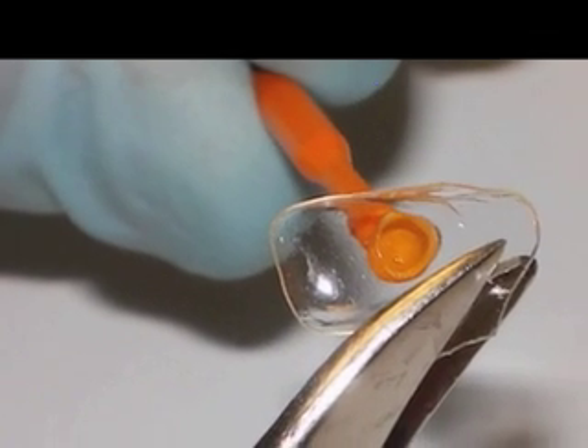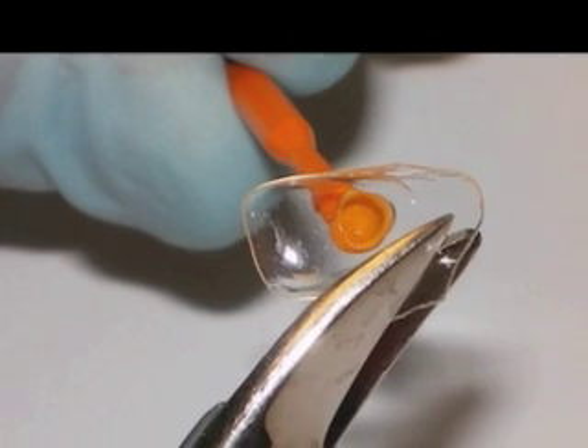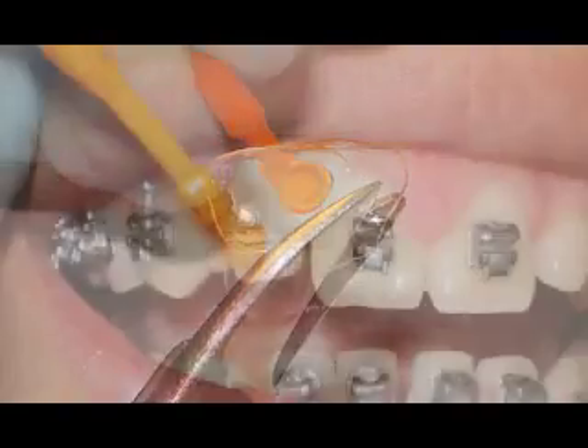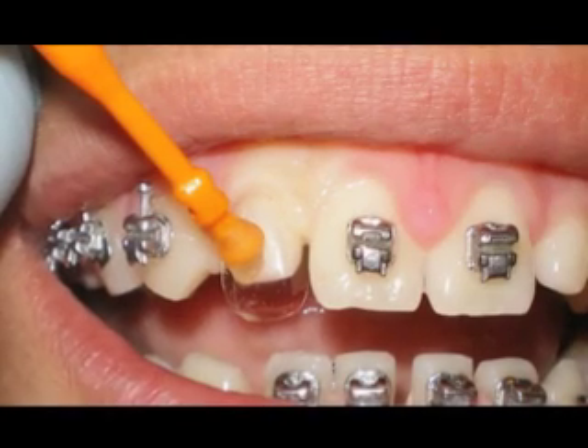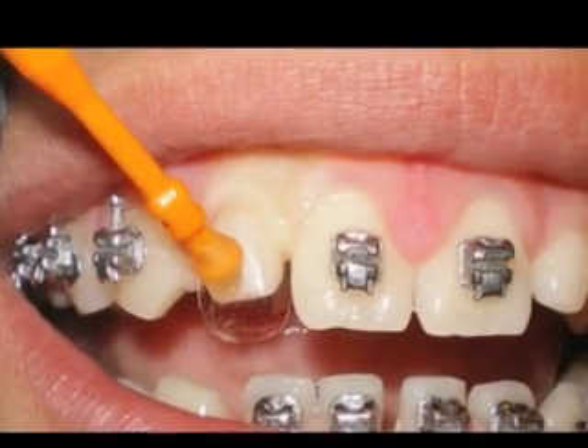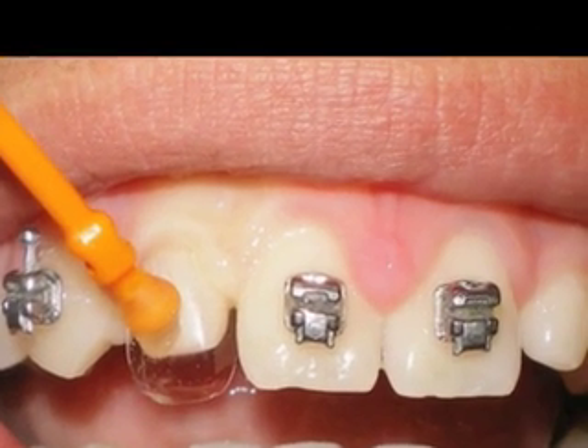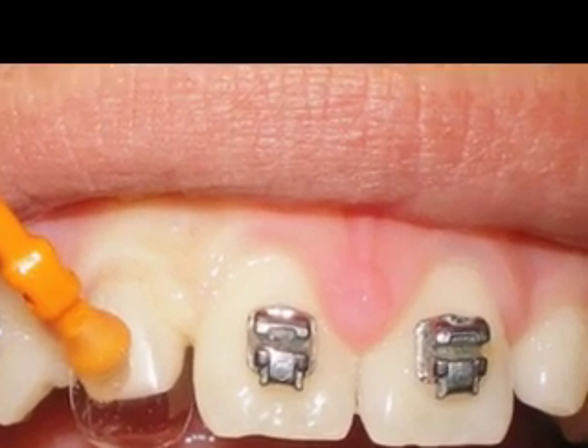I'll go ahead and trim away the gingival portion of the face-o-form with a small curved scissors. Then I'll try the face-o-form on the target tooth and slide it gently under the gingival sulcus. I'd like to trim the face-o-form so that when its gingival margin is slightly into the sulcus, the incisal edge is just about even with the central incisors.